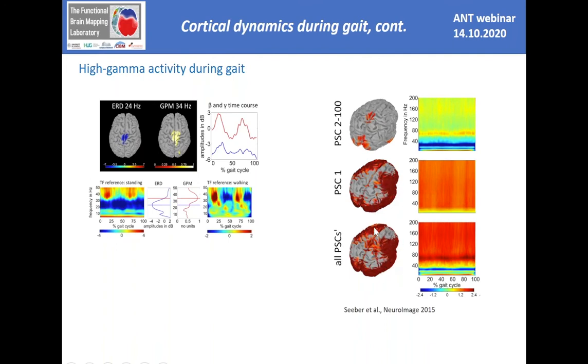If you have these original recordings, and you reconstruct and correct for these artifactual activities, then a much nicer source imaging pattern is left over that is much more plausible, right? Because all this strong activity is gone, and still these central leg area activities are present. Plus, there is also quite a clear narrow-banded modulation at around 70 Hertz that was shown for isolated movements before. So that was very nice, and so we could also look at higher frequencies even when people were walking around.